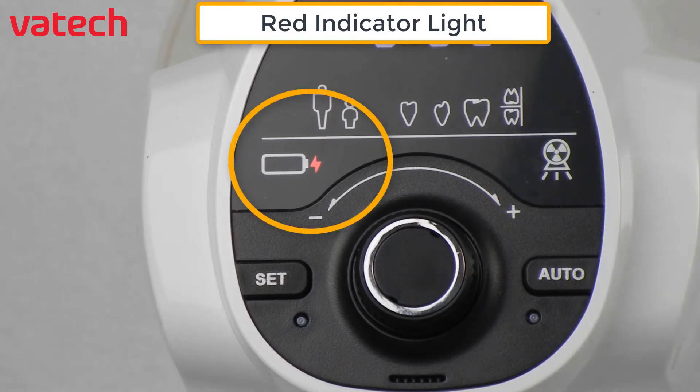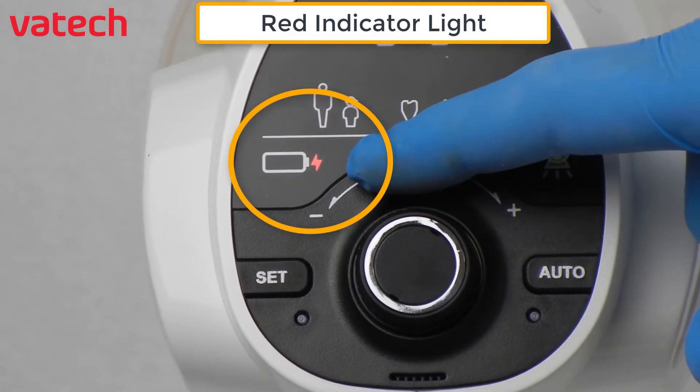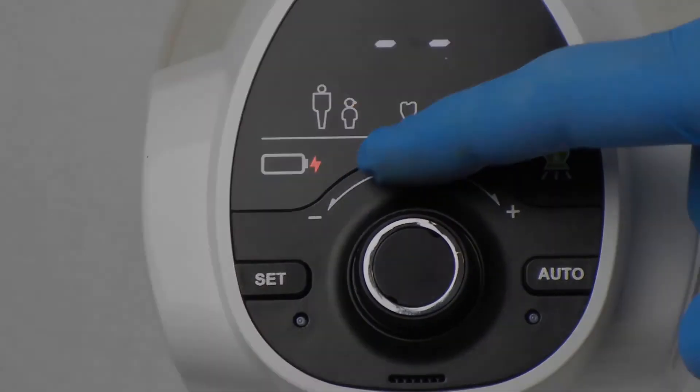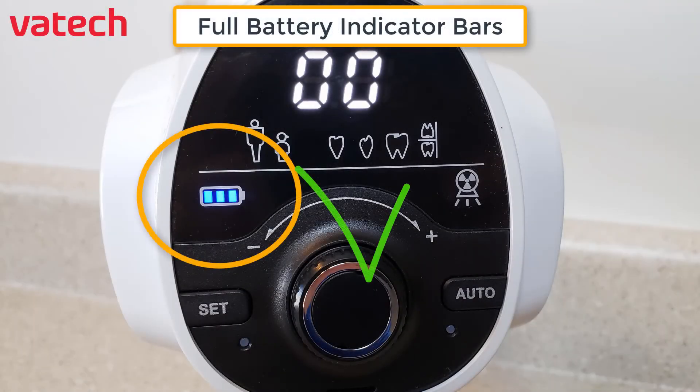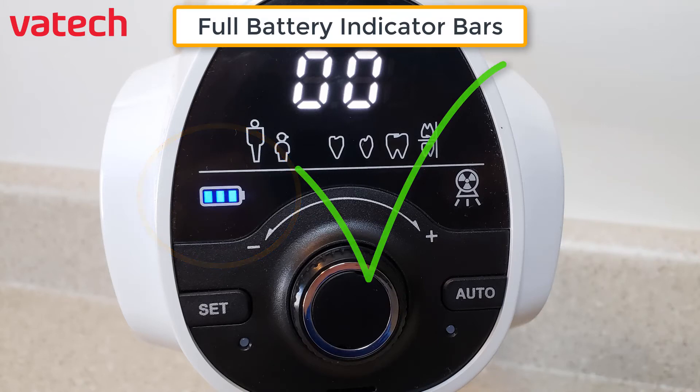You can also verify that it is charging by looking at the red indicator light. When complete, you'll then see three blue bars to indicate the battery is now full and ready for use.